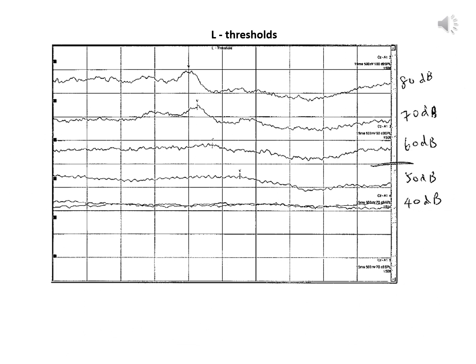Ideally, when there's a question of hearing, the patient is referred to audiology. In audiology, they do hearing tests at many different dB levels and also many different frequencies. And so the outcome of that test is a fuller picture of the hearing for that patient. But if a quick hearing threshold is required, it can be done in the EP lab, and there's a protocol on the machine that's called hearing thresholds.